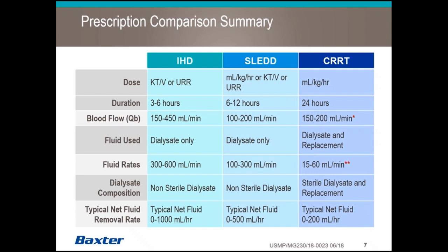Something that is interesting that some nurses do not know when they're starting CRRT therapy is that in the world of traditional dialysis, the dialysate solution that's used is a non-sterile solution. In chronic dialysis patients, or even now in your hospital when a dialysis nurse comes to perform a treatment in the ICU, the dialysate solution that they use is non-sterile. It's not considered a drug by the FDA, it's considered a medical device. The reason it's considered so is dialysate never touches the patient's bloodstream.